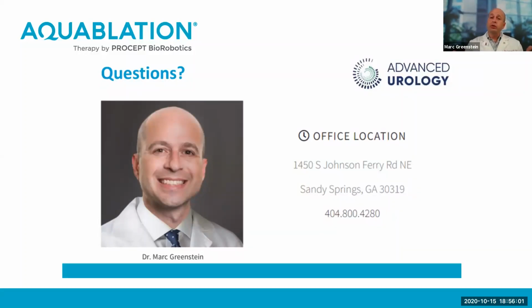We have anecdotal data. In other words, I can interview a urologist that started practicing in 1980 and ask him which patients that they operated on in the 80s have required secondary prostate surgery. And they're going to tell you there's a lot, because after TURP, after aquablation, after Rezum, after laser therapy, that prostate's going to try to grow back.